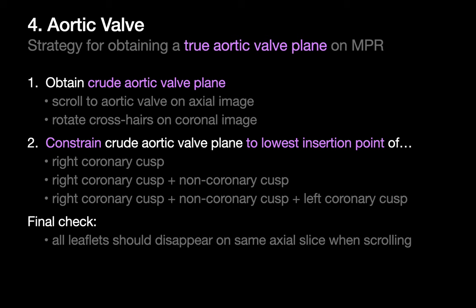A true aortic valve plane is defined by three points in space: the lowest insertion point of the right coronary cusp, the lowest insertion point of the left coronary cusp, and the lowest insertion point of the non-coronary cusp. Your strategy is to constrain your crude aortic valve plane to one of these points, then two of these points, and then three of these points.